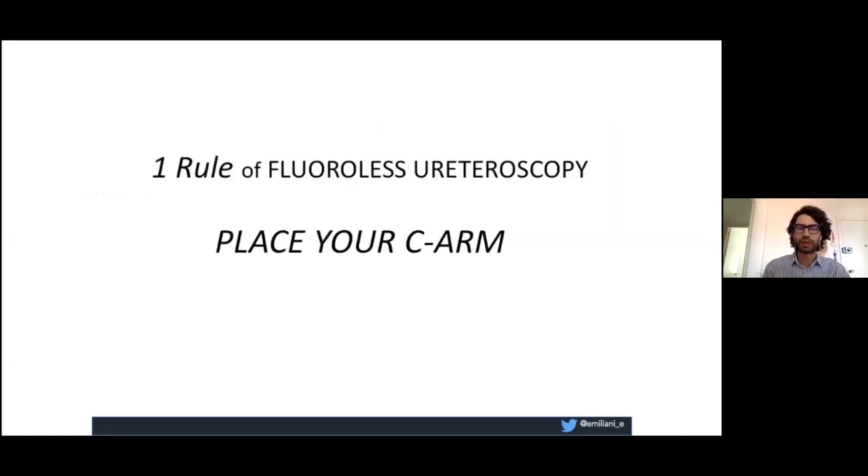The first rule about fluoroless ureteroscopy for me is to place your C-arm. You always have to place your C-arm, even if you're doing fluoroless ureteroscopy, because safety is the most important thing for our patient. So remember this.